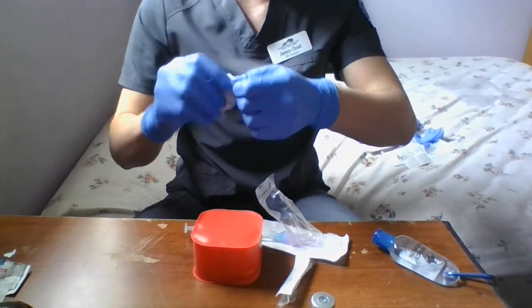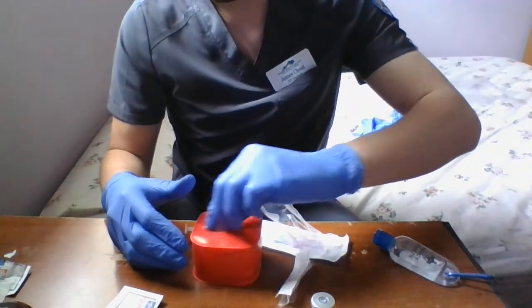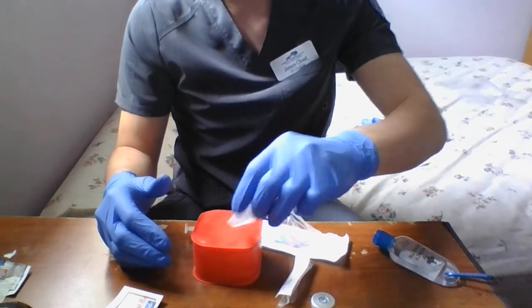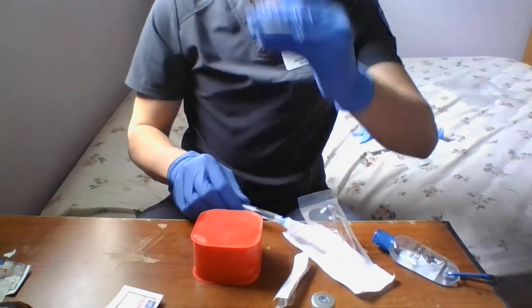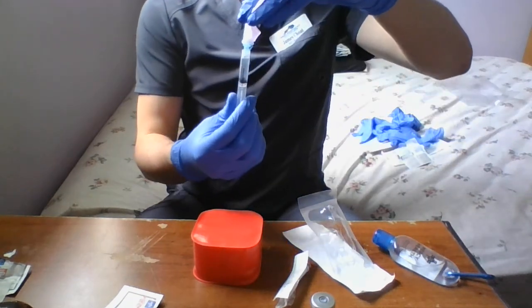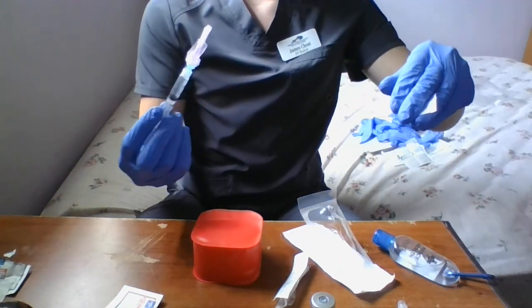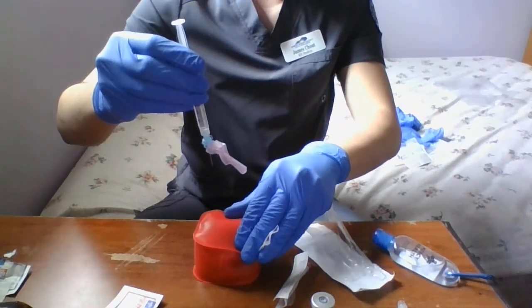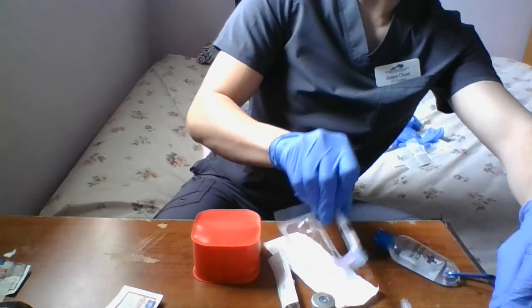Take an alcohol pad here. I'm going to start in the center. Going to go out. You'd go out to 1.5 inches or 2, but in this case, since the pad is so small, I'm going to go ahead and just do the whole thing. I'm going to keep the gauze or alcohol swab right there. I'm going to take off the plastic covering. Bend this just a little bit. Do the swooping method real quick.